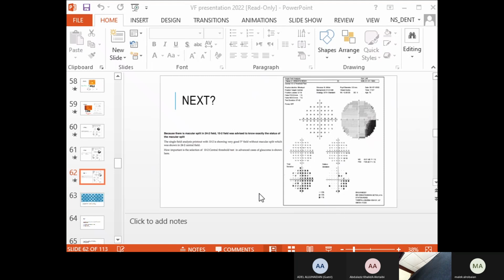What do you think now? Is it a normal or abnormal test? The area that had the scotoma. It's normal.